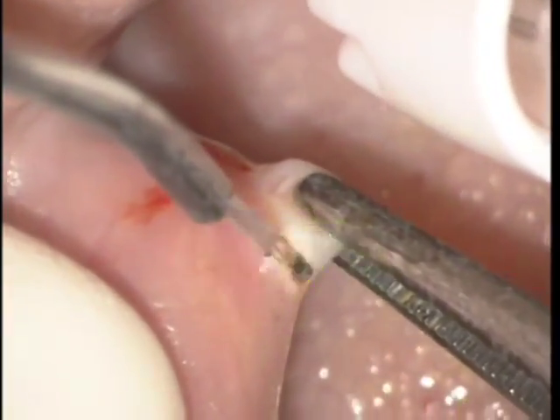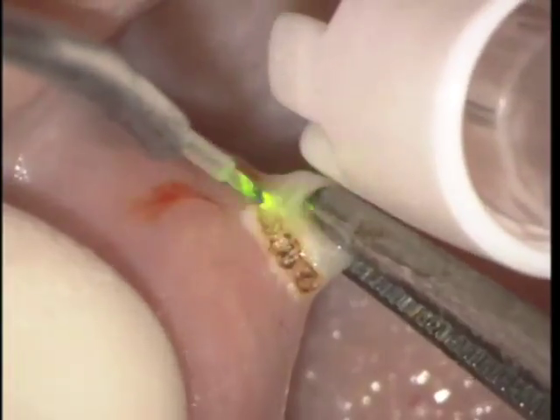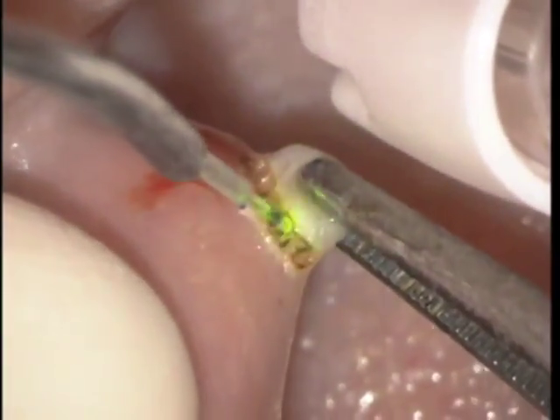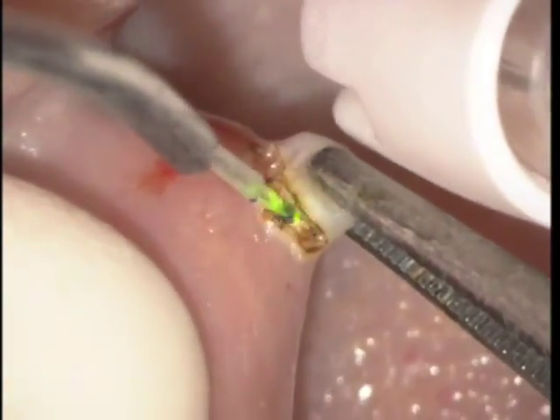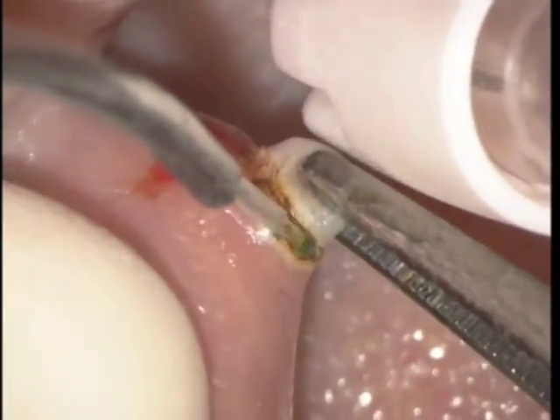In this video you can see that the pulsing of the laser is picked up by the video on the scope and you see that as green pulses. You have to let the laser work — the light work — so you move in slow brush-like strokes.